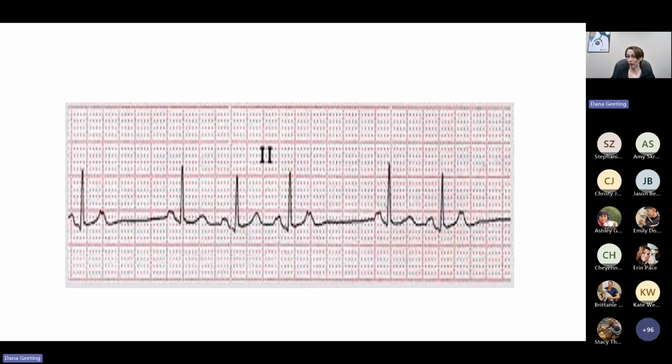If you notice an irregular heart rhythm or rate, you're going to want to check your leads and make sure you're getting good contact. And then those other P waves that don't have the bumps on it, that is like a clue too. Correct. Here you have your other P waves with your QRS. So you have a regular complex right here, and then right here, hidden, is your P wave, but you're missing your QRS.